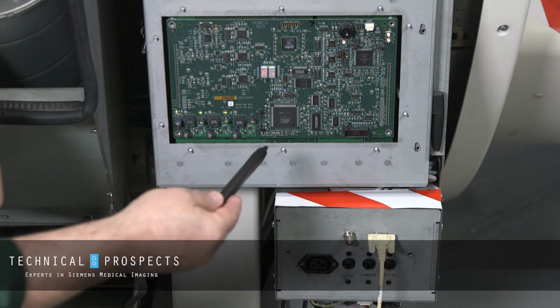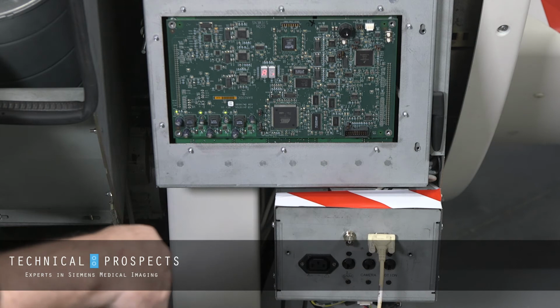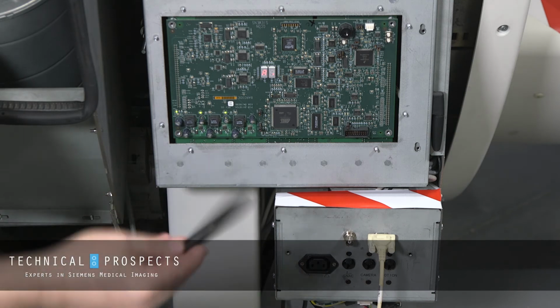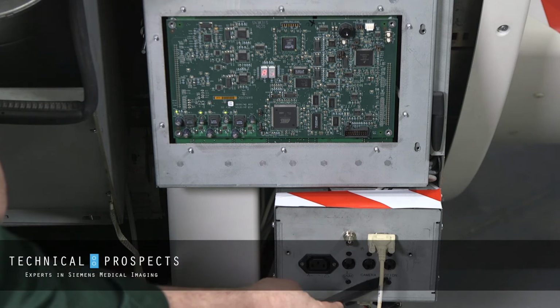Sometimes the motion electronics, the LVAs, HVAs, just get hung or uninitialized for whatever reason and can cause motion faults. As you see here, we have an AI or an A1. That does not mean that necessarily some board out there in the system is hung. To clear that simply, we can come down here and hit the camera and the motion breakers.